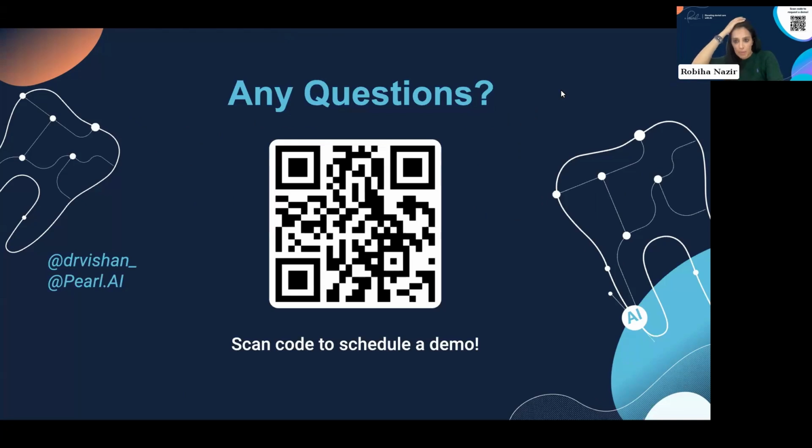We've had one which I feel we may have already answered, so we'll just ask it. Do you find that your patients are more engaged with the treatments and are more confident with their treatment plans? Basically, yes. After showing the patient an X-ray, I'll always go through it in black and white with them first, and then I'll switch to the color with Pearl and go over that explanation, getting the patient involved in seeing why they've got decay. It's got into the dentine. Can you see here? That has really helped.